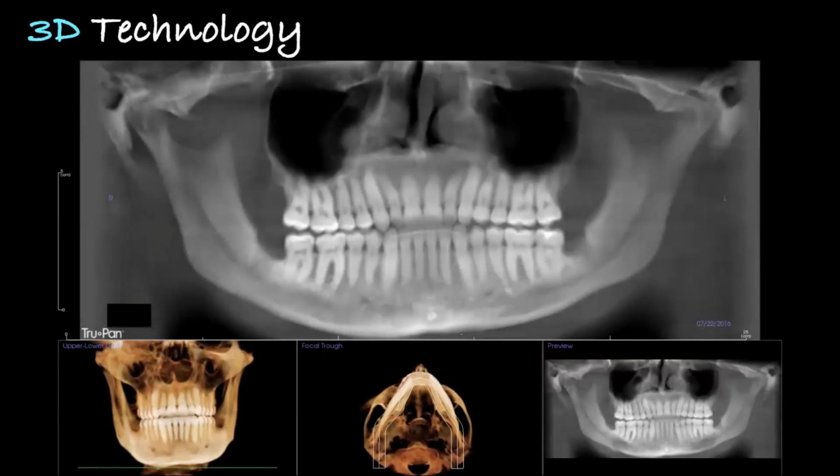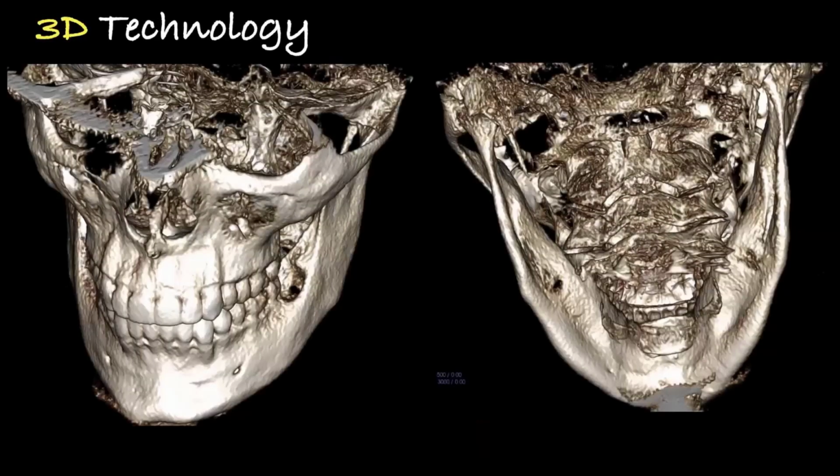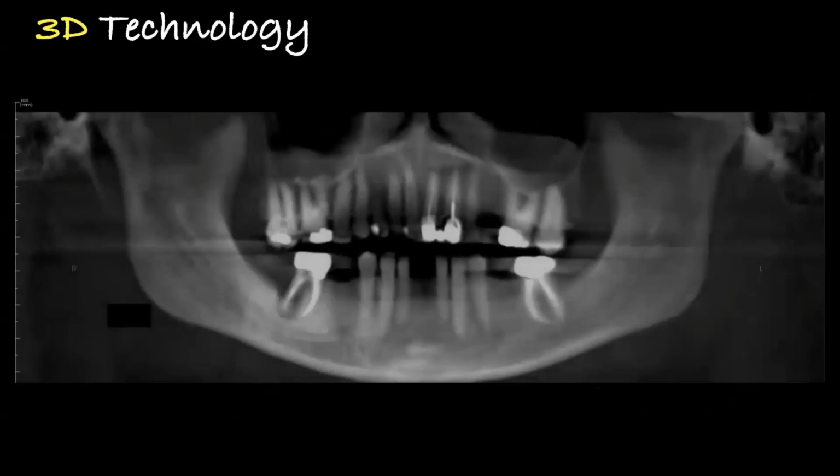In a simple case like this, where we have a patient that had a wisdom tooth extraction done elsewhere and is continuing to have infections and problems, you take a CBCT and you can actually see, hey, listen, there's actually a hole in the mandible where there was debris that needed to be debrided. We went in, cleaned it out, filled it up with just PRF, and the rest is history, healed up perfectly. So just being able to visualize why something's happening on a three-dimensional image provides you with so much more information. And you're never going to get these views in any other type of radiology that you're going to use in dentistry, which is pretty cool.